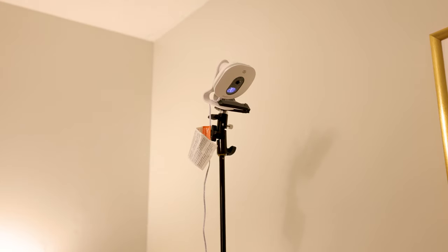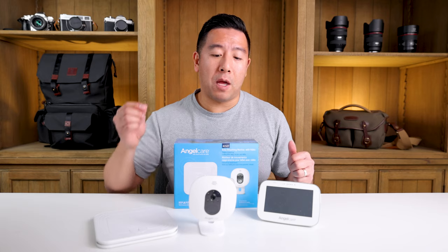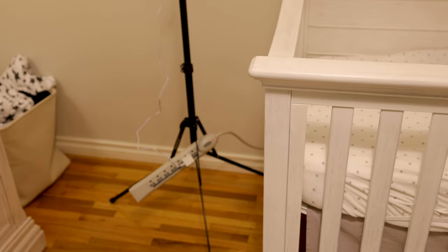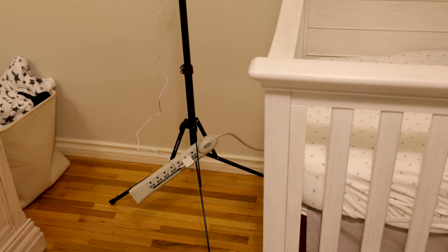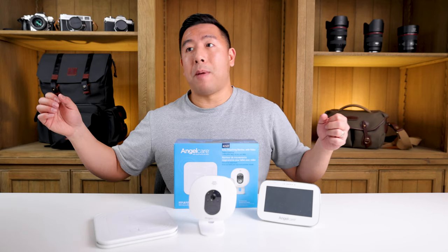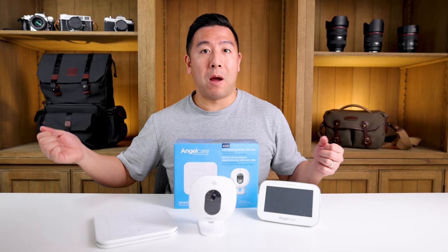The worst thing is the power cable that comes with this system is not long enough — it's about five feet too short. If you mount it at even five feet high, the cable dangles, and I actually had to daisy-chain two power bars to reach my wall outlet.